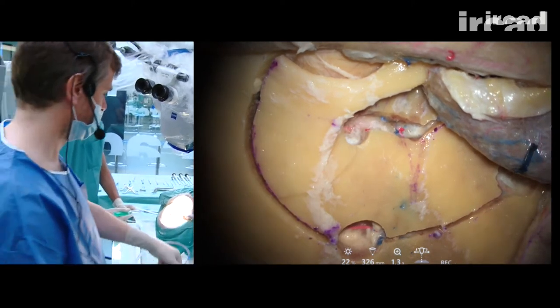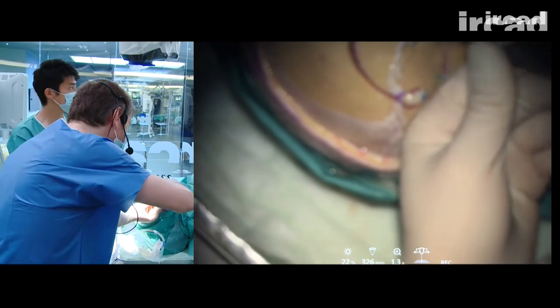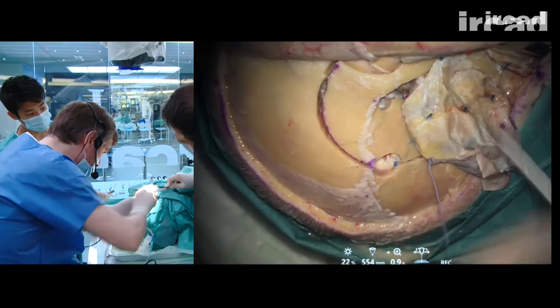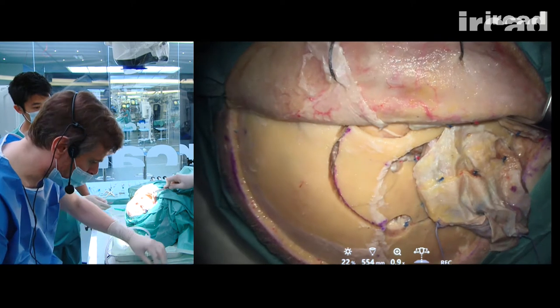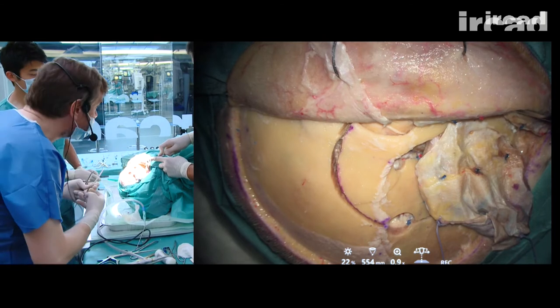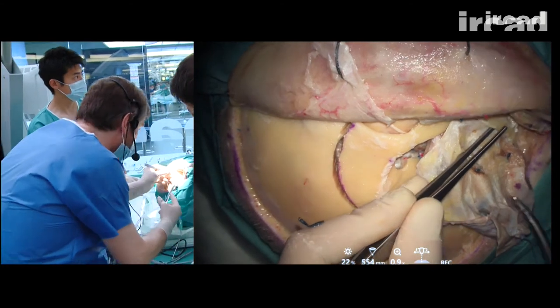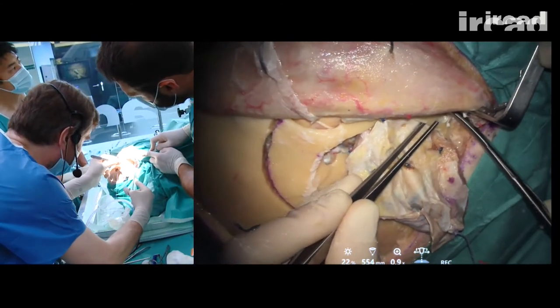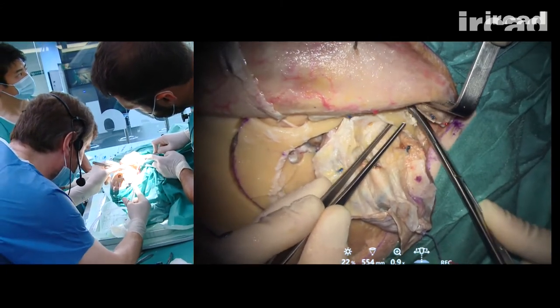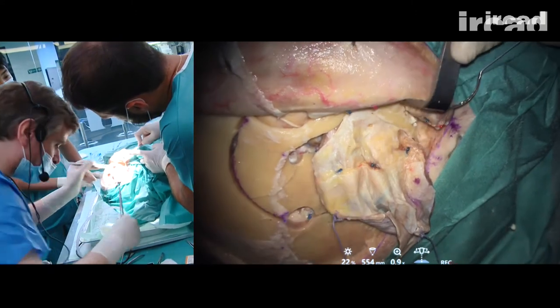Okay, so now we have to release completely the bone flap. This is a little bit difficult to slowly release everything. I need to release here the insertion of the masseter muscle, écarter un peu plus. Okay. Only the posterior aspect of it. Écartez là. OK.